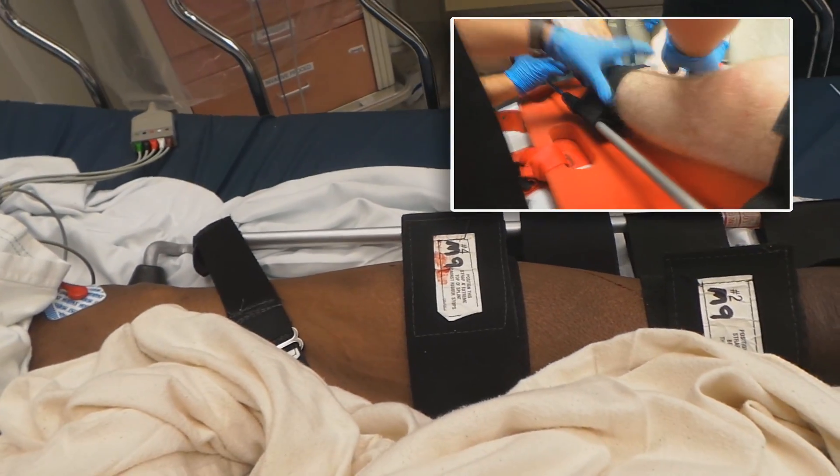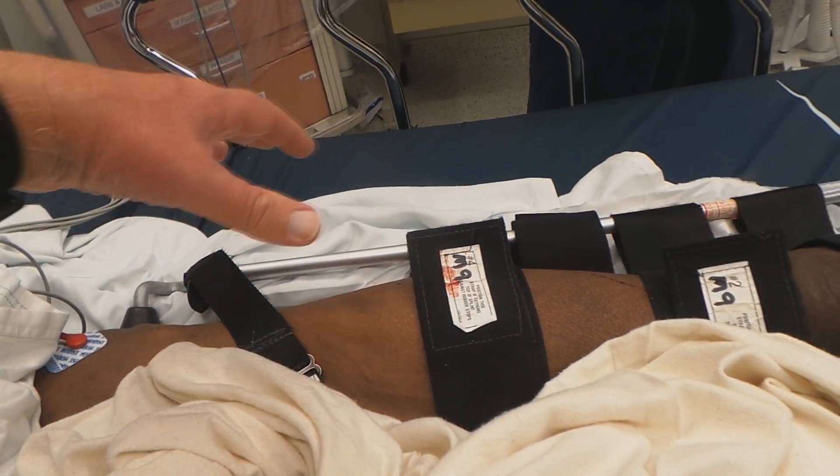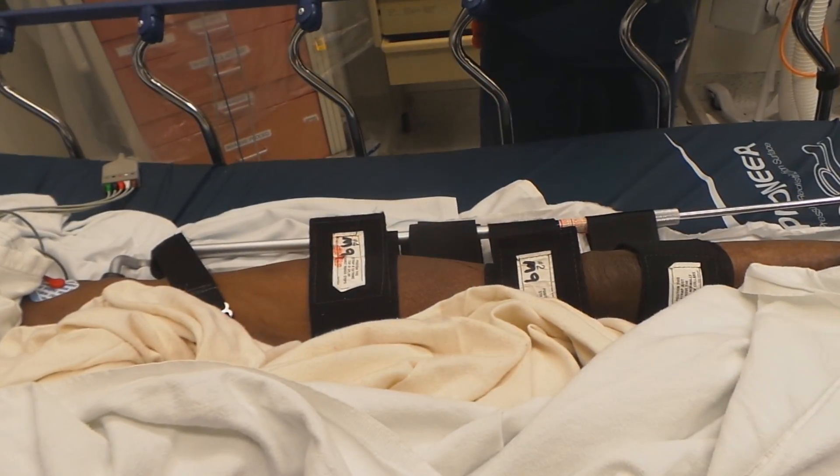I'm a little confused — sometimes you'll see recommendations to have two straps above and two below, but I guess if it works, it works as far as straps are concerned. The real aim is to not have a velcro over the actual fracture site.